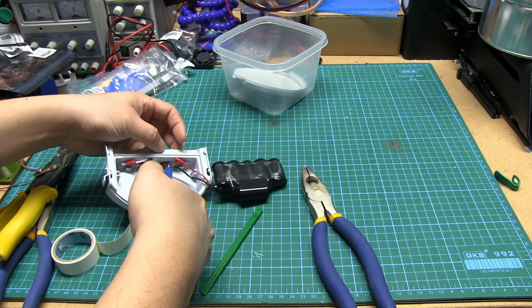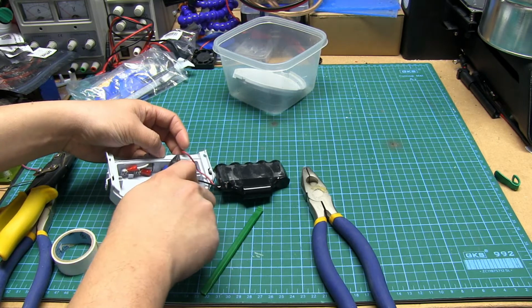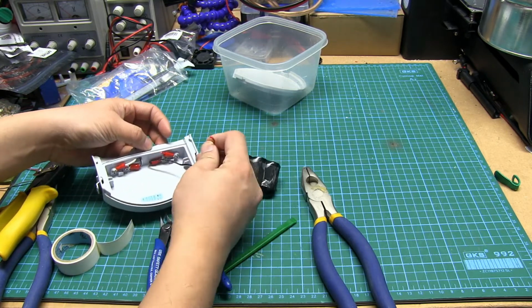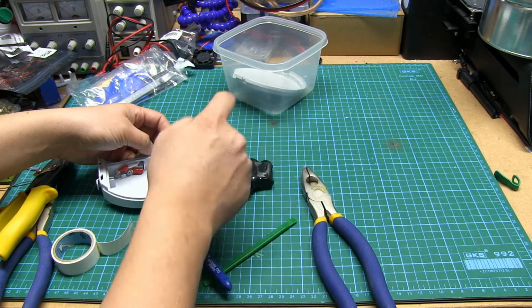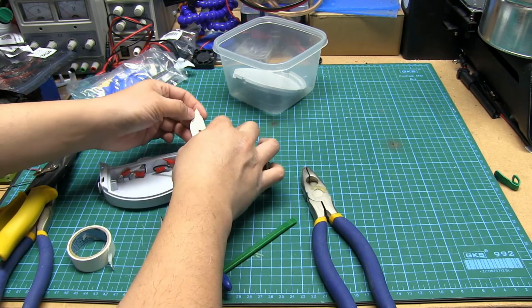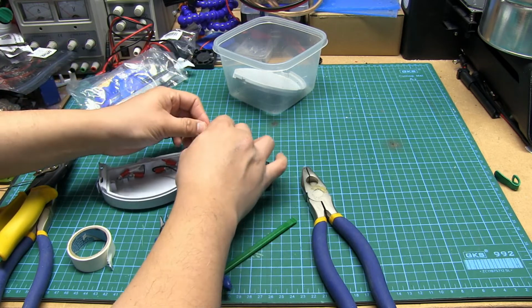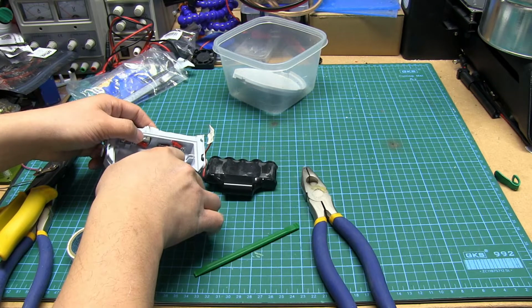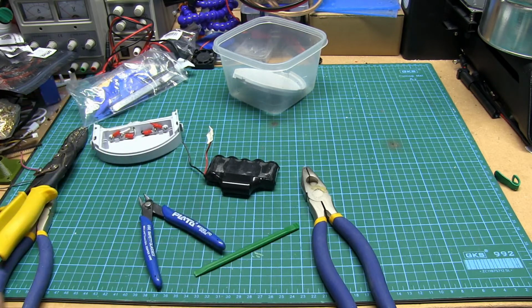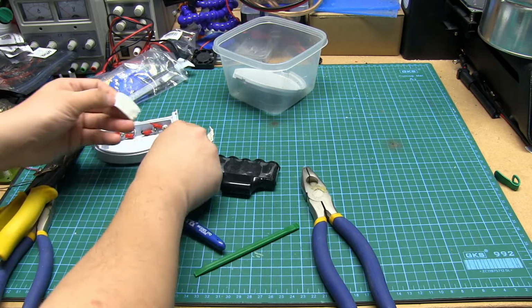Now I'm only going to cut one wire at once because you don't want to cut both and short the two together using your wire cutters. The wire for the battery itself is nothing spectacular. We just really do not want to short circuit. And I'm going to tape that one off just for good measure as I drop more stuff.